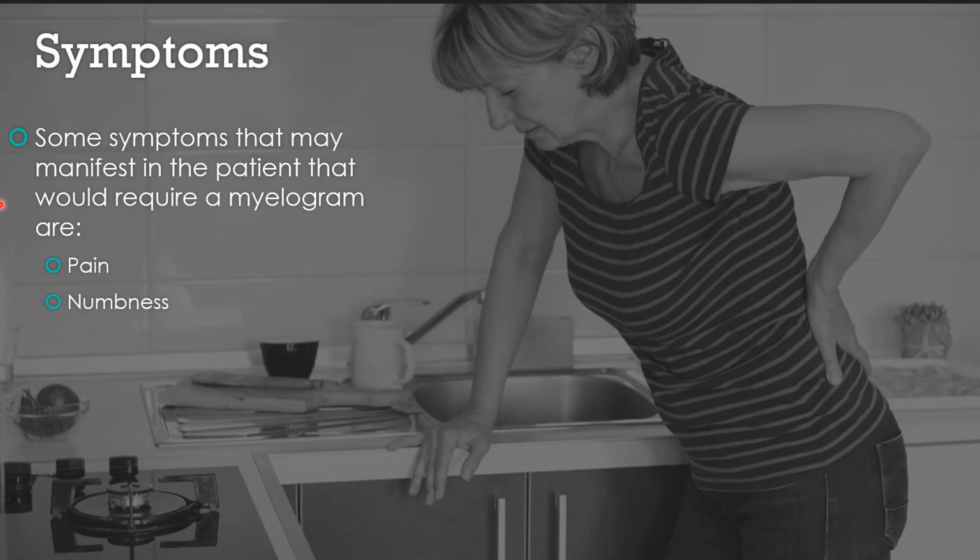All right, back to myelograms. Some symptoms that may manifest in the patient that would require a myelogram are basically pain and numbness.